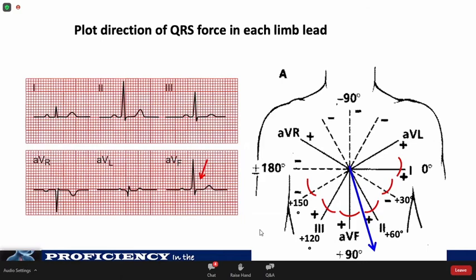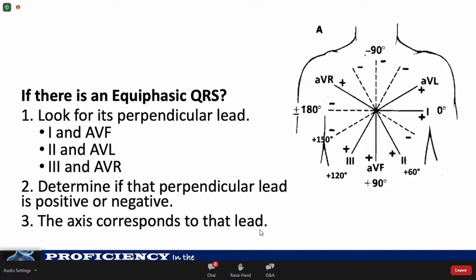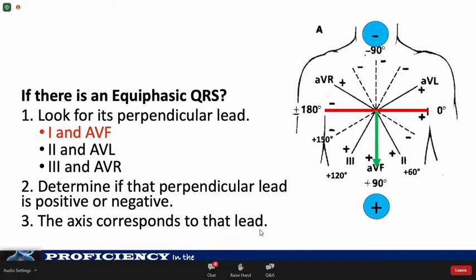If there is an isoelectric QRS — meaning the R wave has the same amplitude as the S wave — look for the perpendicular lead in the hexaxial reference system. For example, in lead 1, the perpendicular lead is AVF, and vice versa. Then determine if the perpendicular lead is positive or negative, and the resulting axis will correspond to that lead's direction. If the QRS complex in AVF has a positive deflection, the corresponding axis will be at positive 90 degrees.